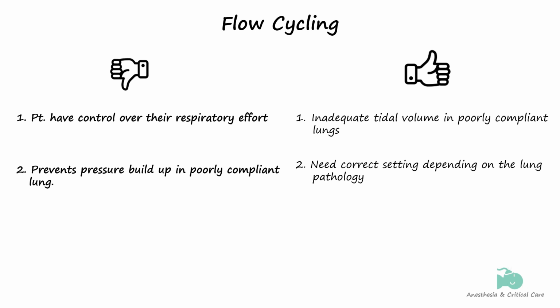However, there are some disadvantages to consider. Patients with poor lung compliance may experience inadequate tidal volumes, leading to insufficient minute volume. The overall comfort of the patient hinges on intelligent settings. Incorrectly low settings could cause uncomfortably deep and prolonged inspiration, while excessively high settings might result in double triggering due to an insufficient inspiratory time.